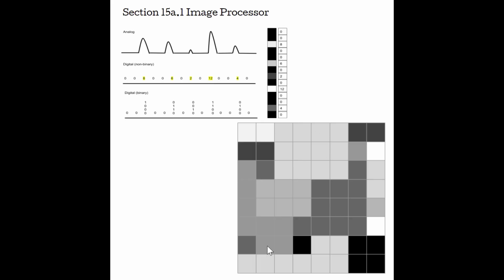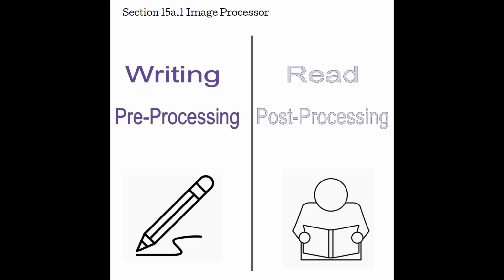Now when the scan converter fills its matrix with pixels, that is one entire frame, and then that frame is displayed on the system display or the monitor. The idea is that this whole pixel matrix is going to be filled at least 30 times per second to create what we perceive as real-time imaging. When the scan converter is filling the matrix with data, the machine is writing, and the scanline data is continuously written over and over as we are live scanning to refresh that image as we see it on the display.